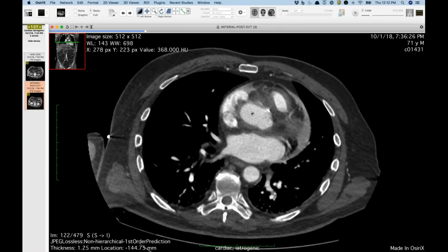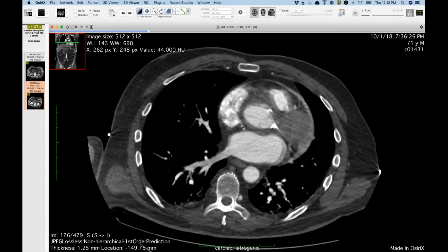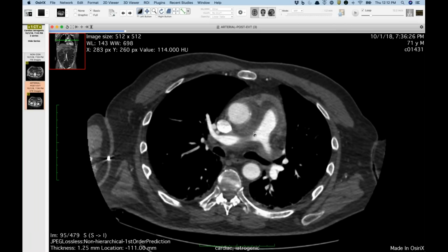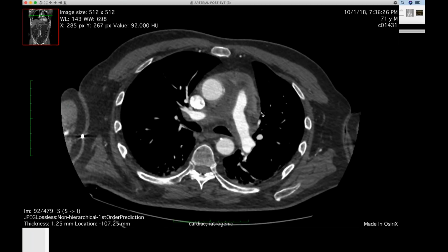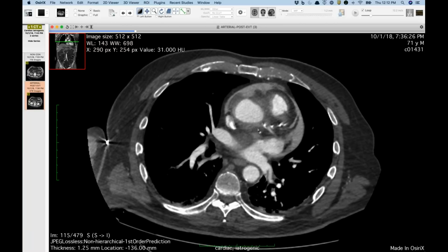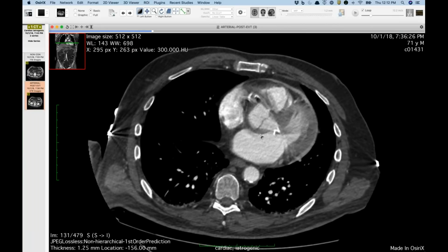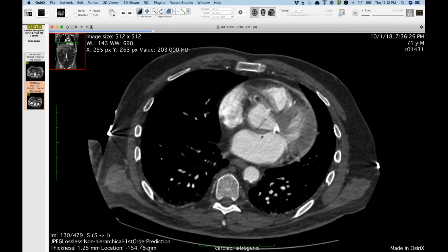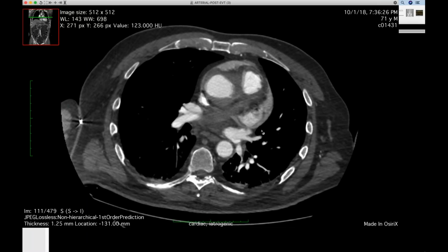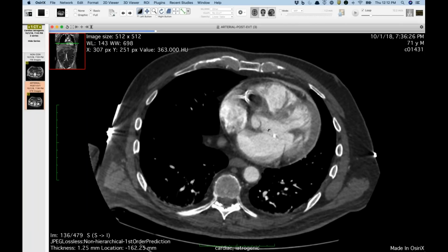When I looked at this, I was wondering if this was a little connection here, but I think this is just the right atrial appendage that happens to abut the aorta here. But this is the first time I've seen an actual shared sheath hematoma from an iatrogenic cause like this. So I thought this was a pretty interesting case. That's impressive. So pressure injection of contrast medium through a catheter that was embedded in the wall of the aorta started that off. Yeah. And the guy was hemodynamically stable.